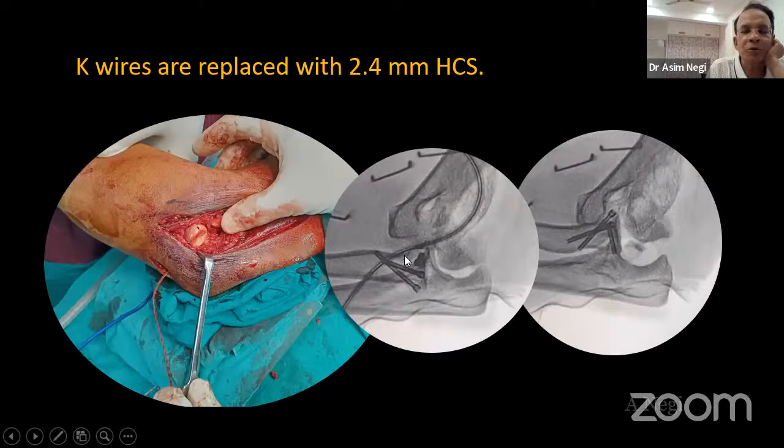If you dislocate the joint, it becomes easier to work on the head radius. The capsular stitch in the coronoid is taken and brought out on the outer surface, as you can see here, but it is not tight so far. That is the last thing we'll do in the end. So the head radius is reduced and fixed in a tripod configuration. There is no plate here.